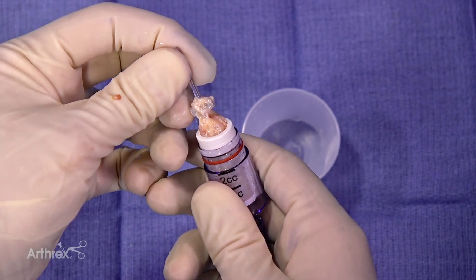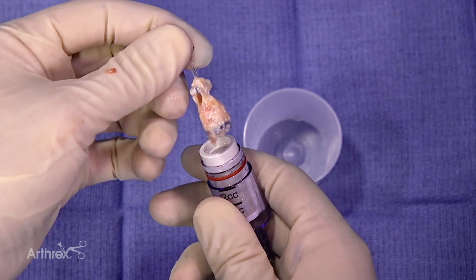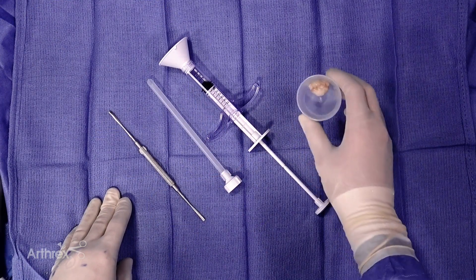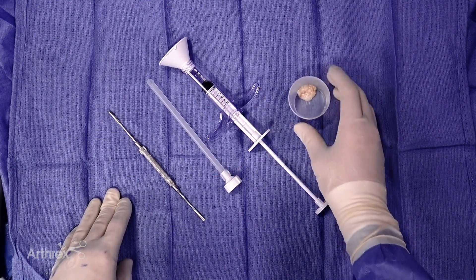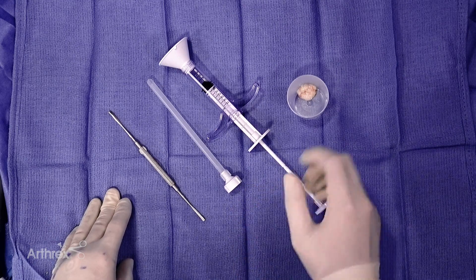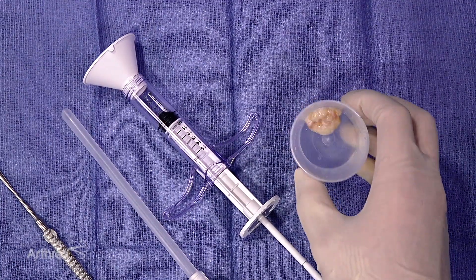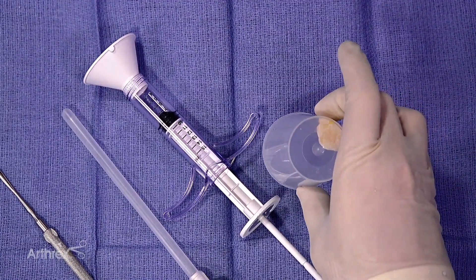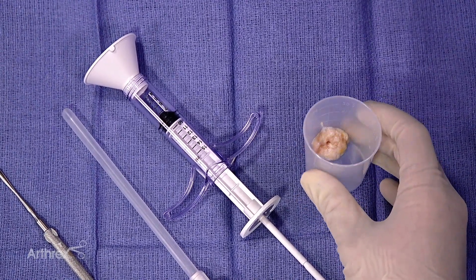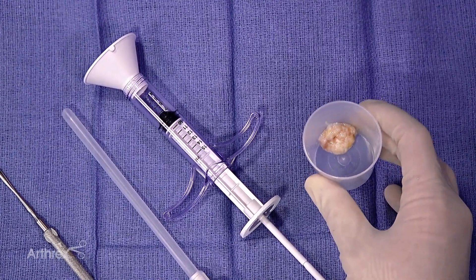It's going to stick right over the top of our rotator cuff. There's actually a little bit of resistance there, but that looks wonderful — it's going to stick right on top of our cuff repair when we're done. We've collected our subacromial bursa and we're going to use our BioExpress graft delivery system to deliver this into the shoulder. One of the things you can notice about this bursa tissue is how adherent it is — if I tilt the cup or even turn it over, it does not move. I did not add anything to this; this is just the minced, filtered bursal tissue.